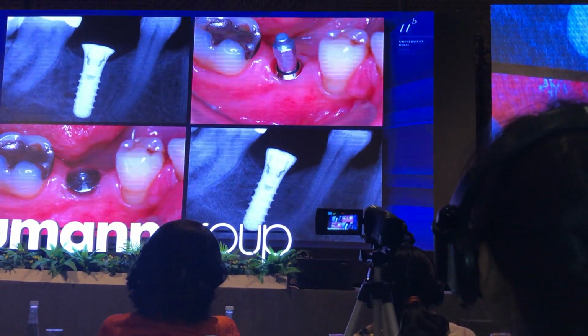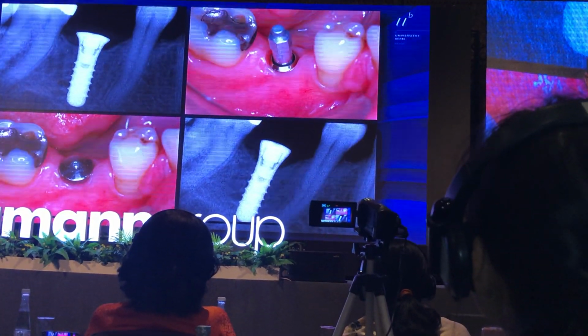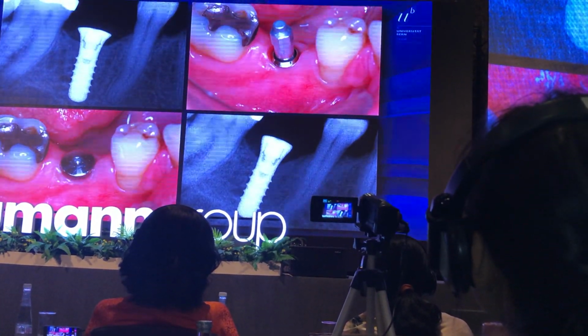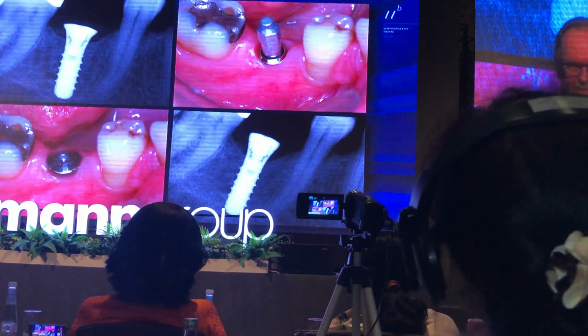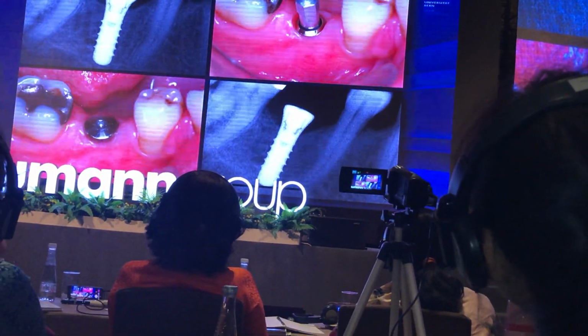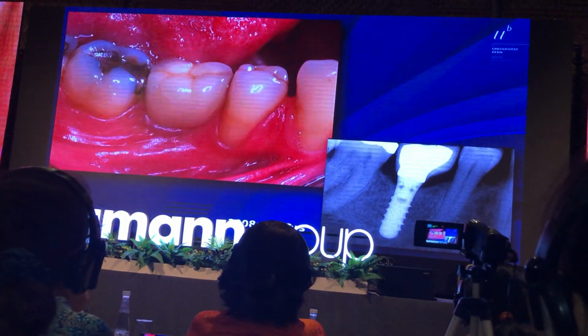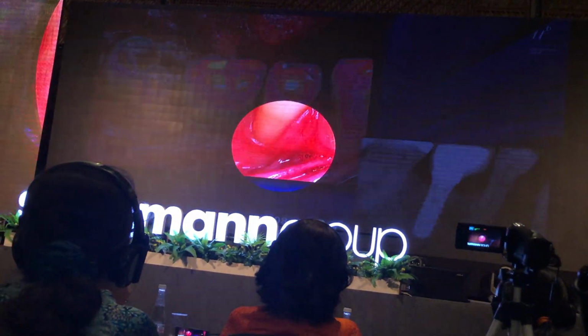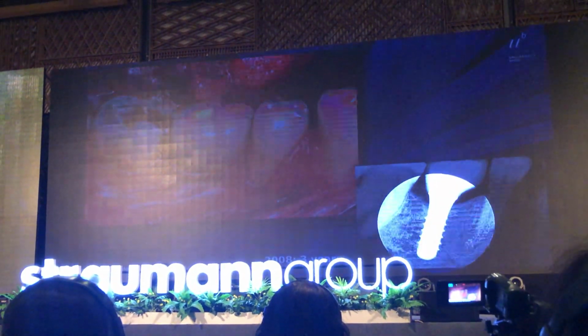Here you see that the reopening implant is well integrated. I'm sure at that time we had been waiting 3 months, because it's almost 15 years ago that we did that surgery. And you see, then the case was restored. Here you see in 2008, the 3-year follow-up, the radiograph looks excellent.